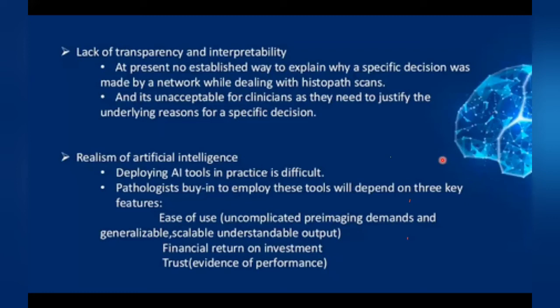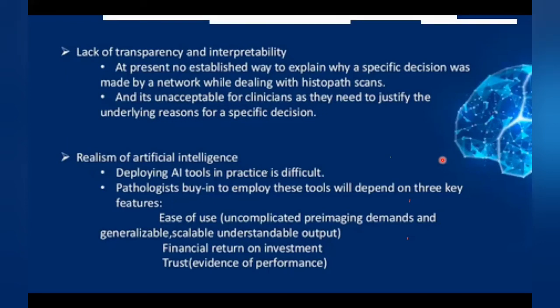And what is the financial return on investment? For all the businessmen and pathologists who are involved in diagnostic setups, the ROI is very important. How soon will you get the investment out? Since it's a very expensive equipment you buy, a single slide scanner would cost anywhere from 20 lakhs to 30 lakhs. Multiple scanners will go up. The Philips one, which I was talking about, was in the range of 3 crores or something like that. So it's an expensive modality. And you need to develop trust for the results which are coming out. And it happens with time.